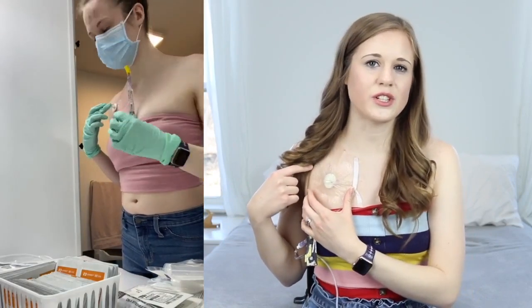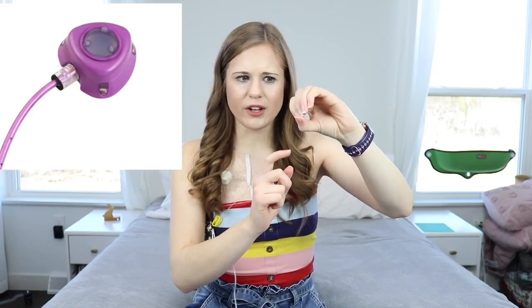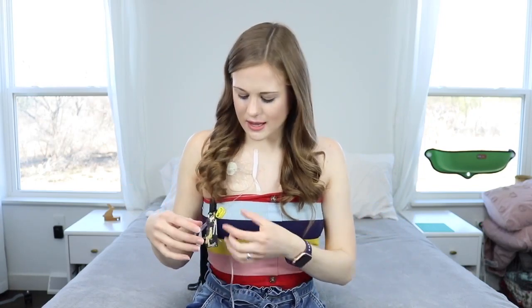The port is accessed by placing a special needle into the device implanted under the skin — the needle goes through a thin layer of skin and directly into the port. The port has a big rubber stopper in it, kind of like when doctors draw medications from a little bottle through a rubber seal. The rubber on a port is much heavier duty than a medication bottle. Once you have the needle in, you are accessed. You cannot get this area wet or submerge it, as that leads to a very high sepsis risk.